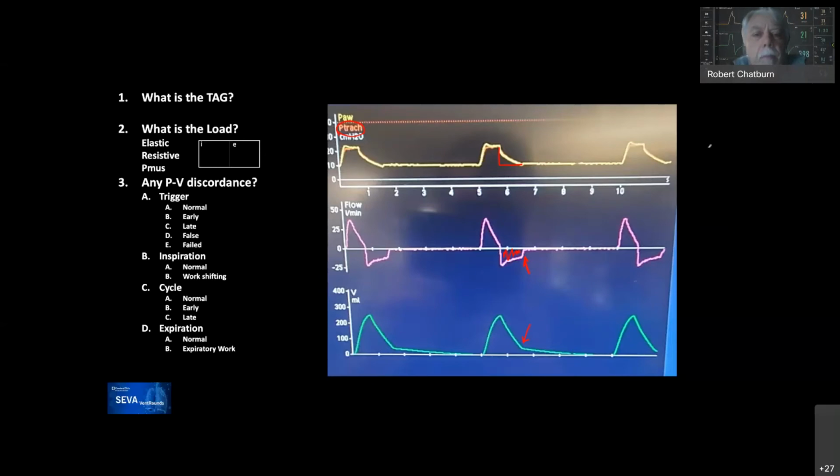Great. I've got a question. Since I'm not familiar with this particular event, are we talking about the exhalation valve? Is this a single limb circuit with an exhalation valve, a mushroom valve, or are we talking about a ventilator internal valve malfunctioning? Internal. Yeah, if this is a Hamilton, they'll be all internal valves. Is it a G5? I don't know. Ariel, do you recognize this vent? Yeah, I don't know, to be honest with you. It's unfamiliar to me.